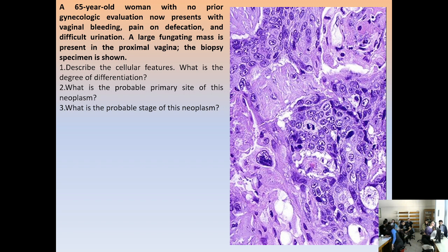Quite a lot. It's immunohistochemistry. There are markers of squamous differentiation, immunomarkers. You have a special stain. And when these cells are stained, for example, for the marker P40, you understand that it is a squamous cell carcinoma, as you have postulated previously. So a technique to define the nature of malignant cells when morphology is not enough is immunohistochemistry.